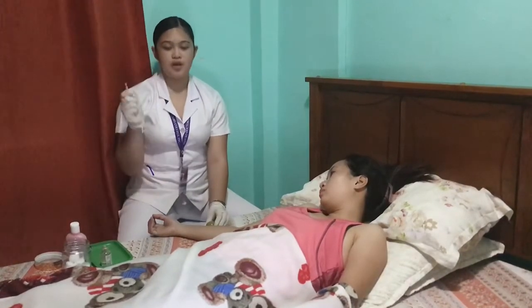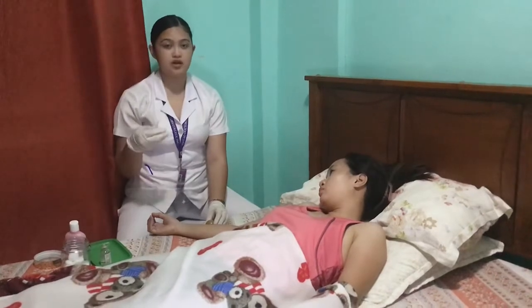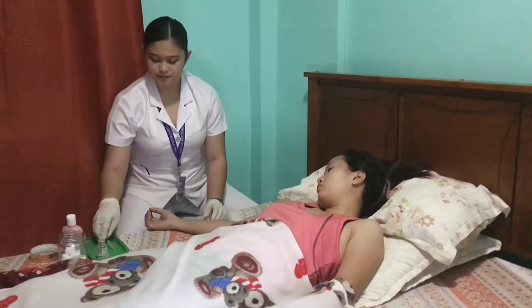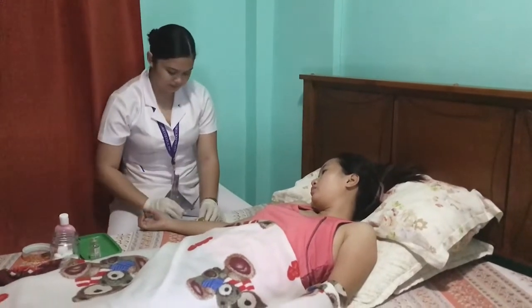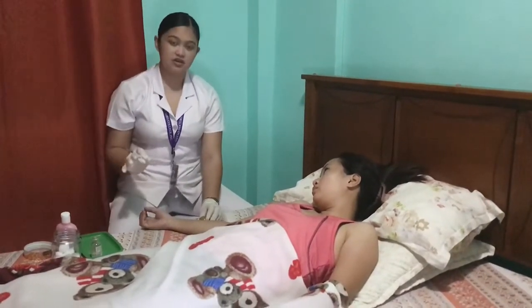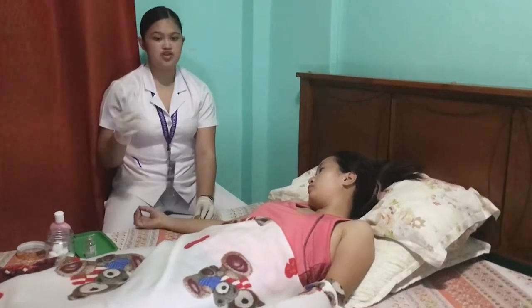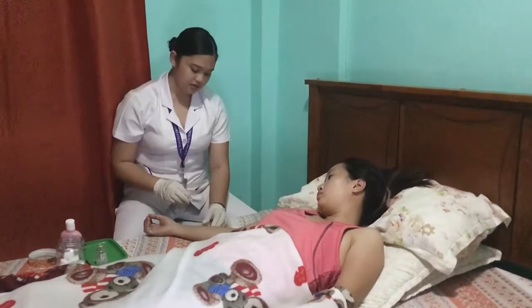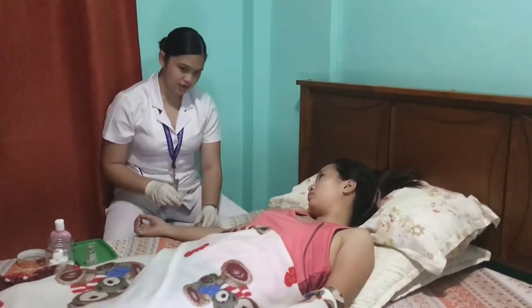Then remove the cap and hold the syringe between the thumb and forefinger of your dominant hand. Then level the needle pointing up. Then stretch the skin taut at the injection site by pulling gently with the thumb and forefinger of your non-dominant hand. Then slowly insert the needle.